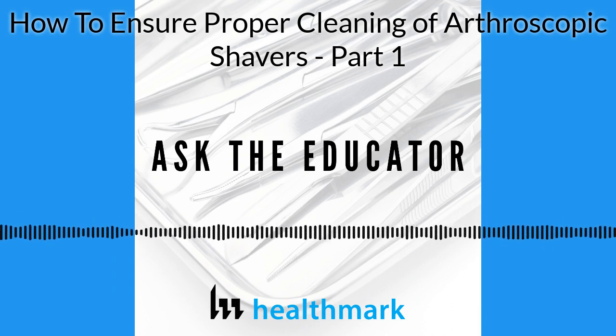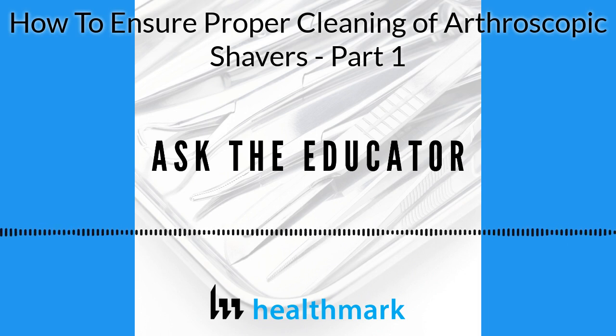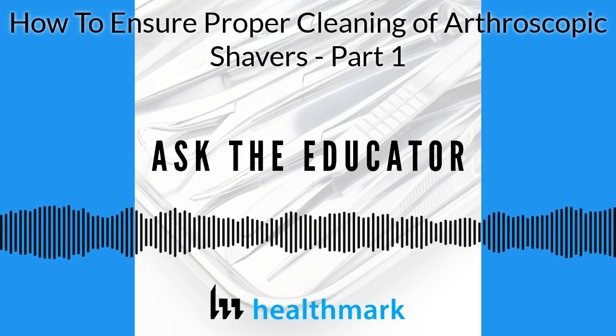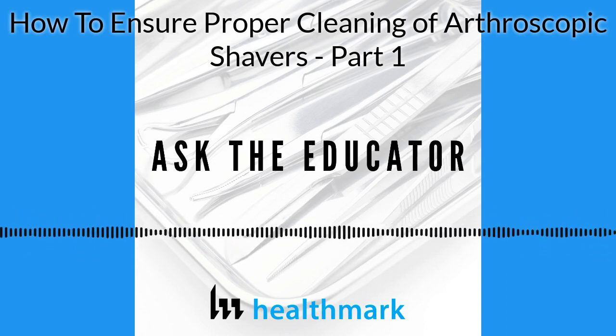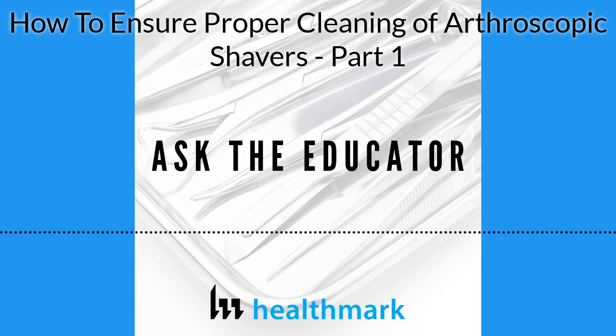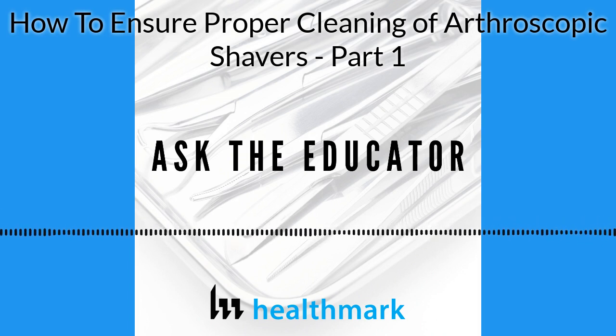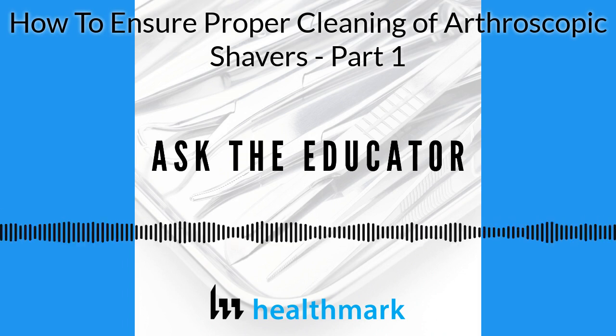Yeah, Kevin, you were just saying, unfortunately, right now there's downtime and you can take advantage of this. And even if you don't have downtime, you probably should have some quality process in place where you do some type of tray audits. So how I look at it is, let's go pull some trays that have shavers off the shelf and open them up and start examining them. And how do you examine it? Well, you also need to get your IFU, your instructions for use, and see what it says and start applying that where this would be done on your clean side.